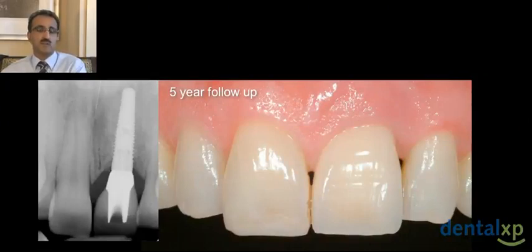and we take a simple crown and bridge impression of that abutment with a cord and a standard impression technique that we would do to make a crown on a tooth. And then that is where we make our final crown, and the abutment is staying in from the start. So, in other words, by managing all these aspects, we are trying to optimize the stability of the tissue complex around our implant restorations.